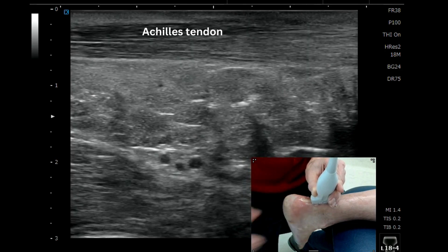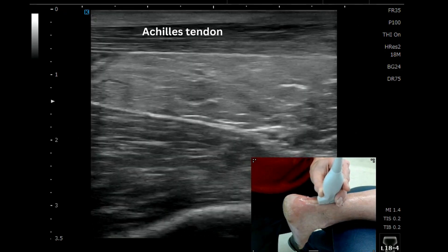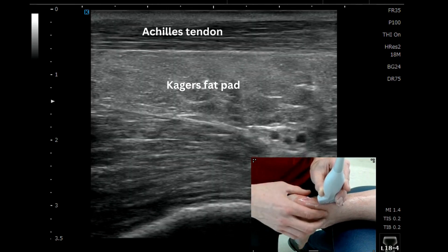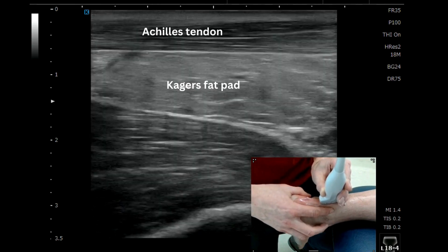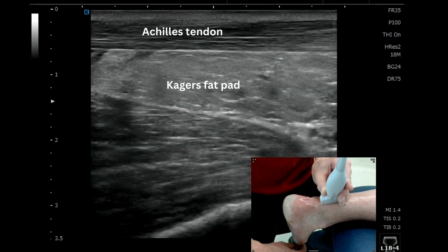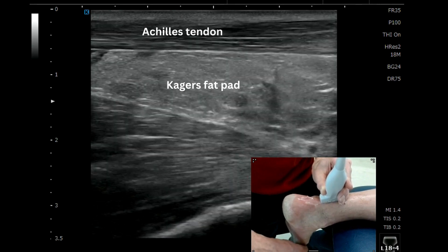As we come up the leg, we can change our depth a little bit, and we can start to appreciate the more hyperechoic appearance of the Kager's fat pad sitting deep to the FHL tendon, which we can move with first MTP joint flexion and extension.